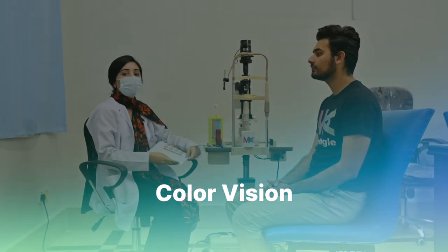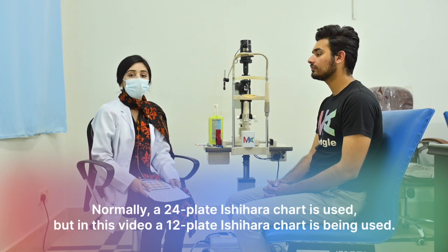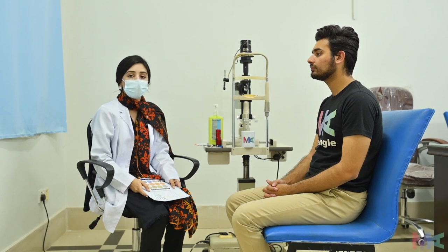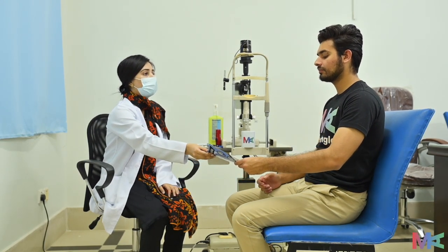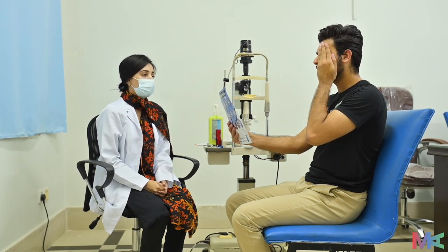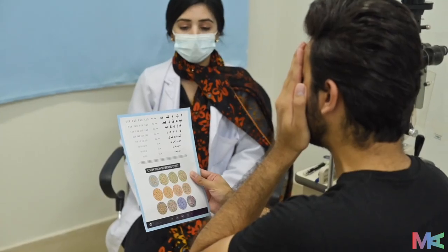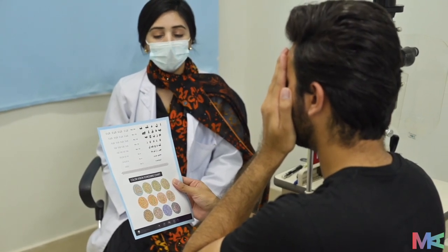Now we will be assessing the color vision. For this, ideally an Ishihara chart of 24 plates is used. In this examination we are using a 12-plate chart. Isko pakad ke apni ulti aank band karein and kindly read the numbers for me: 12, 8, 6, 29, 5, 3, 15, 74, 6, 57, 5, 42.